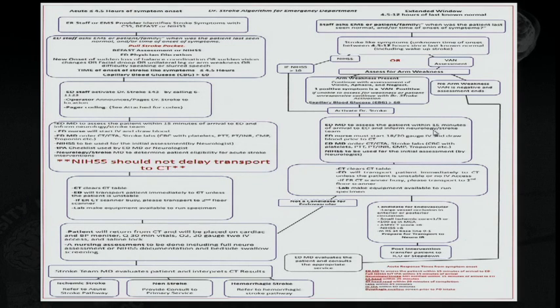And this is the pathway, and we get activated, and it's kind of busy, but yeah. So here the ED places the orders for the CT and the CTA, and we will be adding, this is our A, this is our B, and we will be adding that CTP over here on the B side.